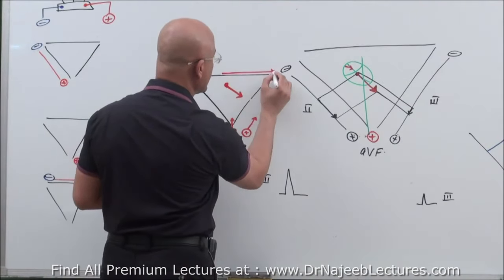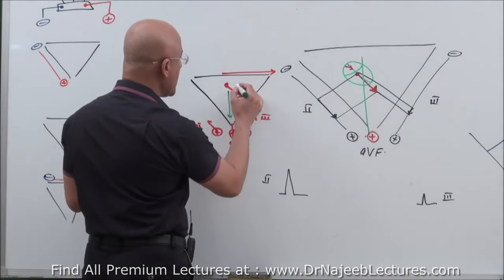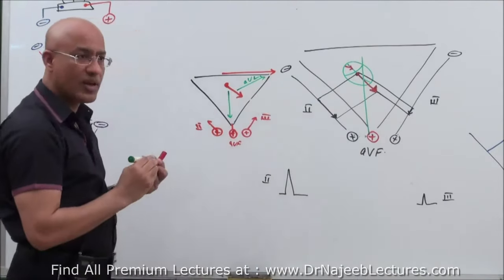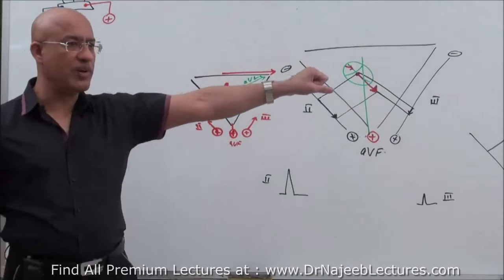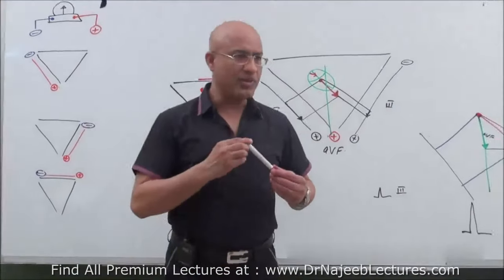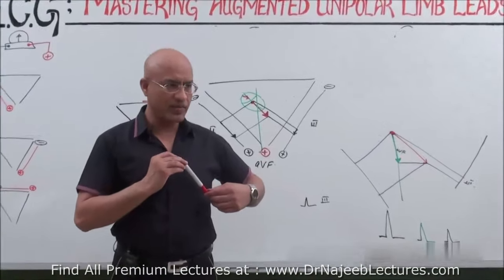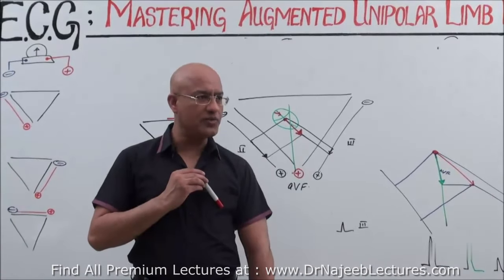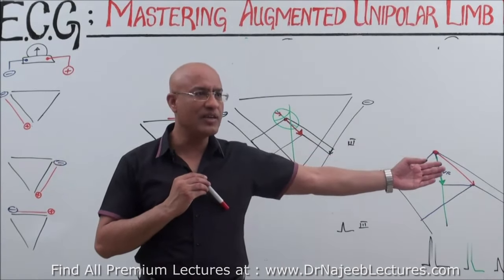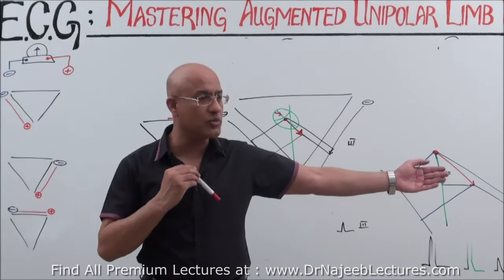Lead number 1 was this axis, right? But what is the axis of this? Okay, this was AVF. What is the axis of this? AVL. Now, lead number 1 has its positive electrode on the left side. Another way to explain it: major ventricular depolarization is going downward and leftward usually, around 60 degrees, right? All the leads which are inferior will detect positive deflection. And all the leads on the left side will also detect positive deflection, because the vector moves not only downward, it also moves leftward.